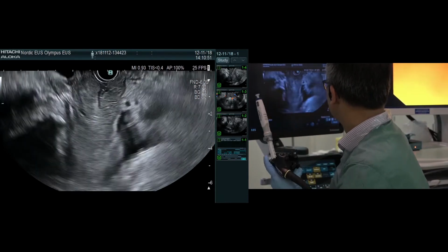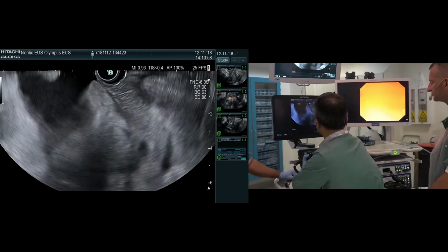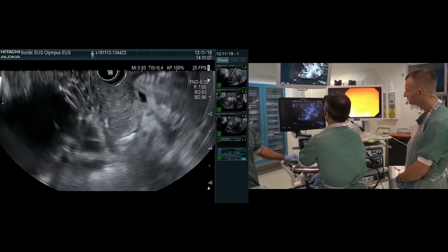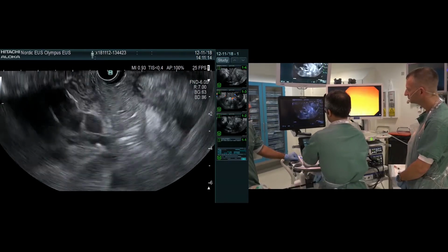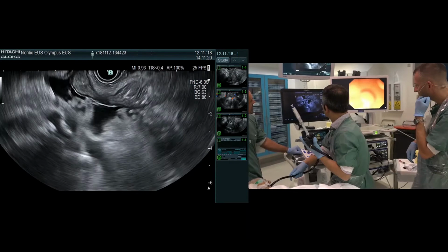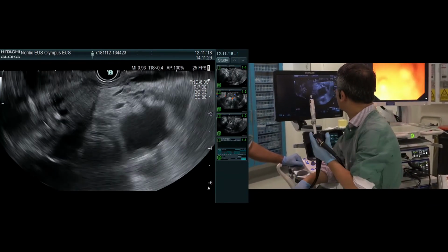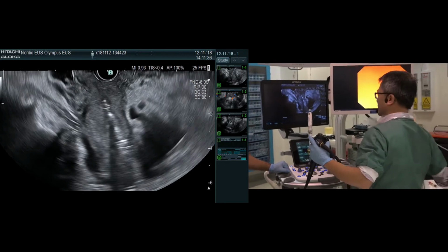So that was the spot you took the biopsy from, but I wonder if I should go, because I think it is coming on the right side now. I try to. Wow. So this is what often happens, that once you're in the distal duodenal position and you slowly withdraw your endoscope, and eventually now the tumor is coming on the left, you lose the position. It could be.